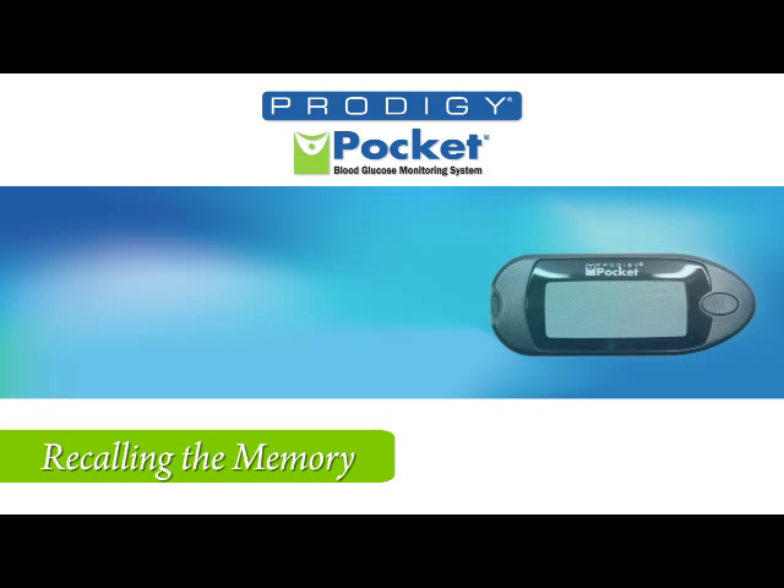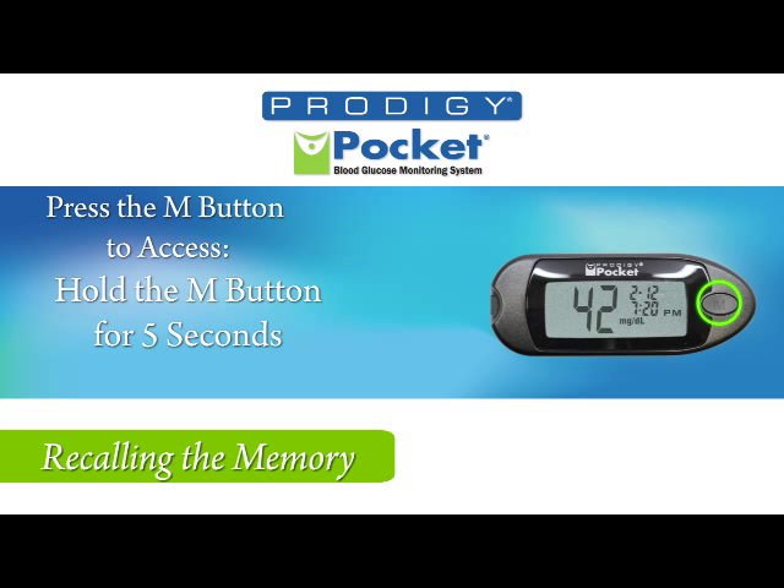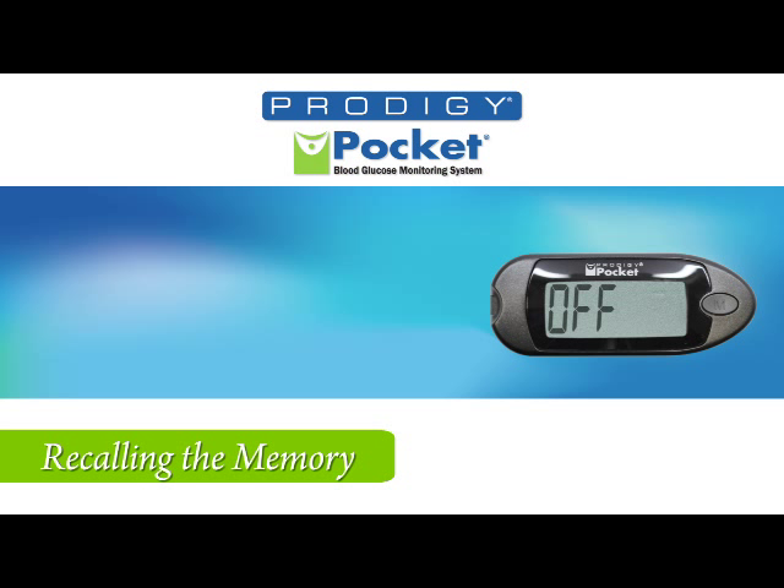To recall test results, press the M button while the meter is off. Press the M button again to enter memory recall mode. The meter will report the 7-day average first. By pressing the M button, you advance to the 14 and 28-day averages. Press the M button again and the most recent individual test results will appear. Continuing to press the M button will provide a maximum of 120 test results. To exit memory mode, press and hold the M button for 5 seconds, or leave the meter alone for 2 minutes and it will turn off automatically.